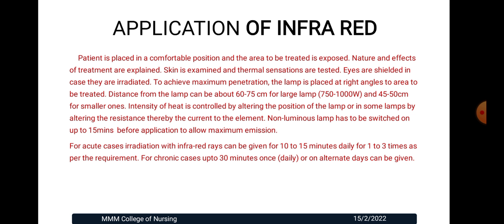For acute cases, irradiation with infrared rays can be given for 10 to 15 minutes, daily, 1 to 3 times as per the requirement. For chronic cases, up to 30 minutes once daily or on alternate days can be given.